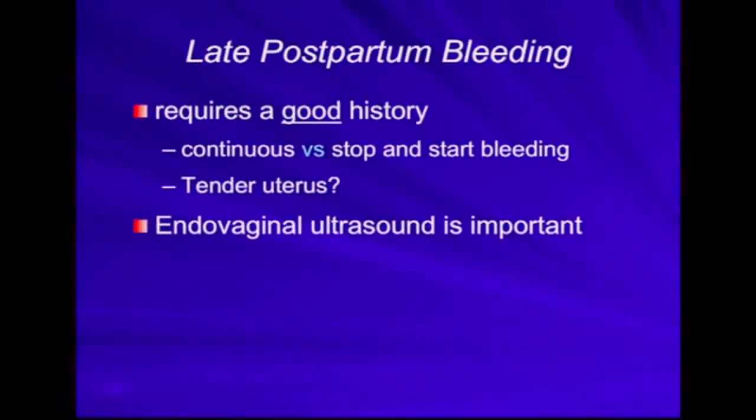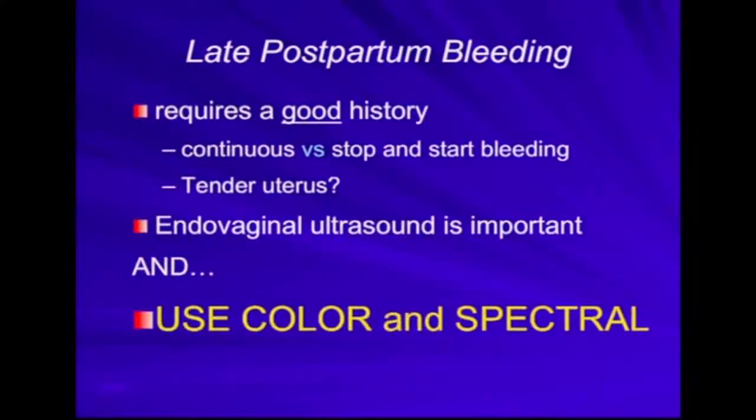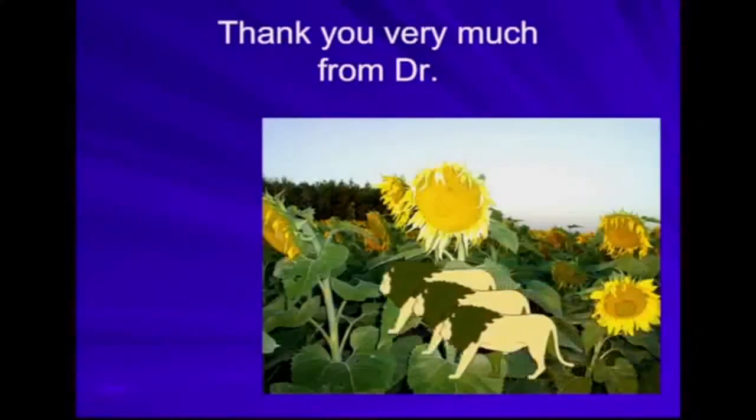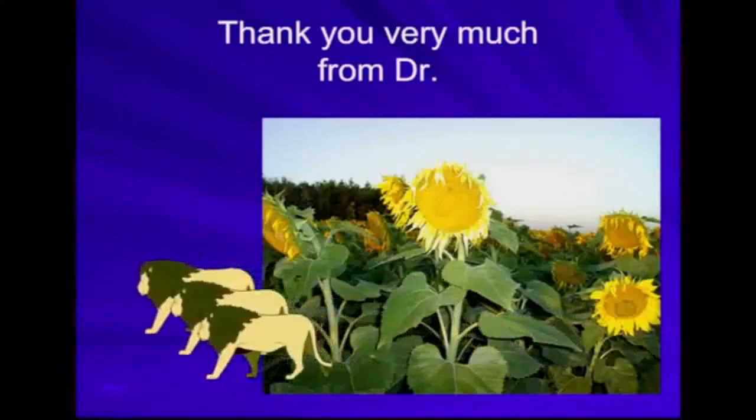Endovaginal ultrasound is absolutely critical. And remember, use color and use spectral. So examine the uterus, push on it, ask if it's tender, use color always to see if there's increased vascularity, and use spectral to see whether or not this is high velocity flow.